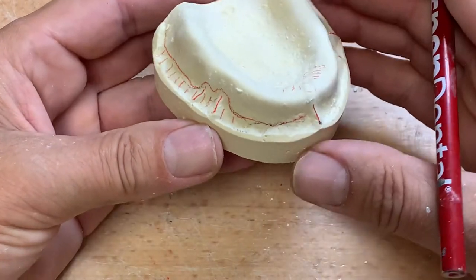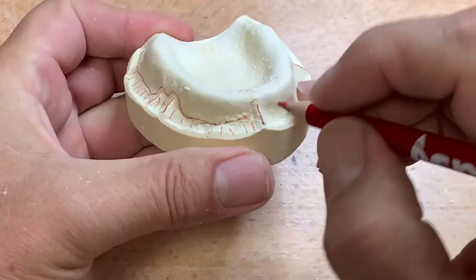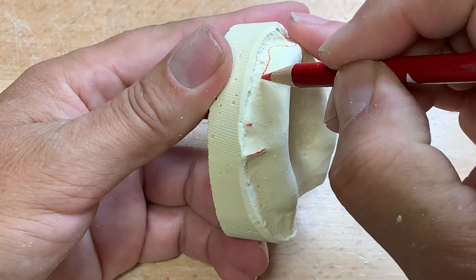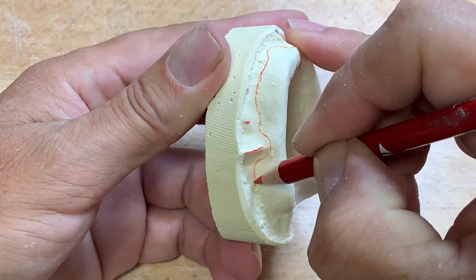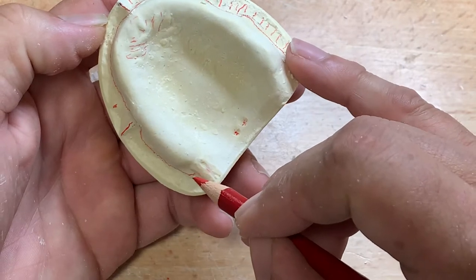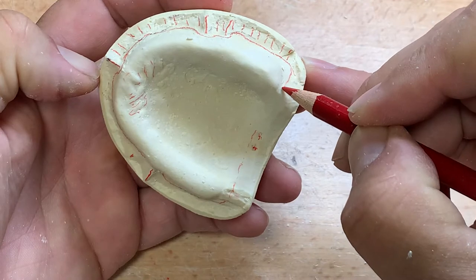I'll draw hash marks here. You can see outside this border — which is an estimated border that I'm reading from the impression of where the attached and detached mucosa is — around these frena, which are the most critical areas. I also see a couple of palatine fovea, which is demarcating my vibrating line to the soft palate, so I'm going to stay slightly anterior to those with the tray. The dentist can elongate the tray onto the soft palate if they wish.